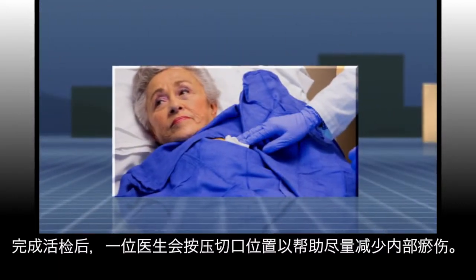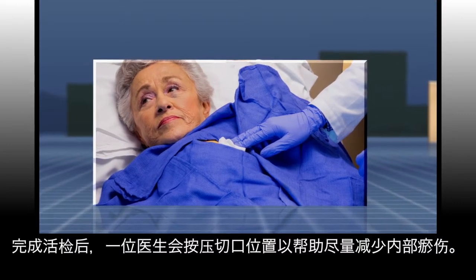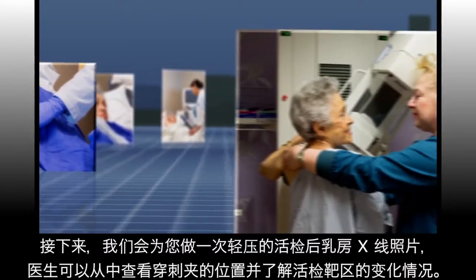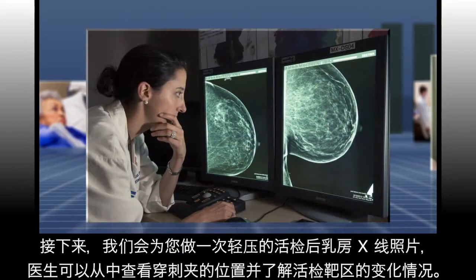After the biopsy, one of the doctors will put pressure on the site to help minimize internal bruising. Next, you will have a gentle post-biopsy mammogram so the doctors can see the location of the biopsy clip and what changes were made to the biopsy target.